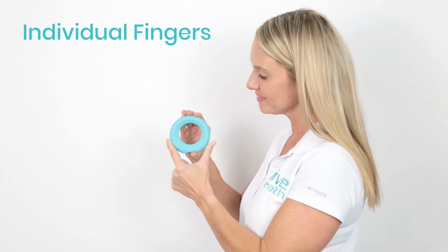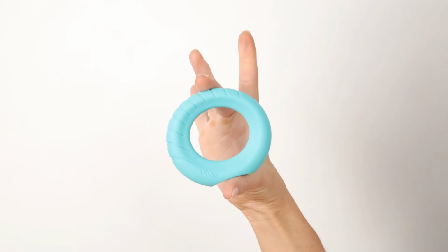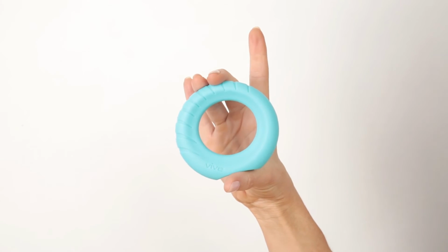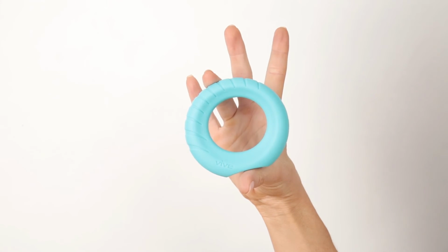Individual fingers. Squeeze with the ring between your fingertips and thumb, using only one finger at a time. This can also be performed with the finger extenders.